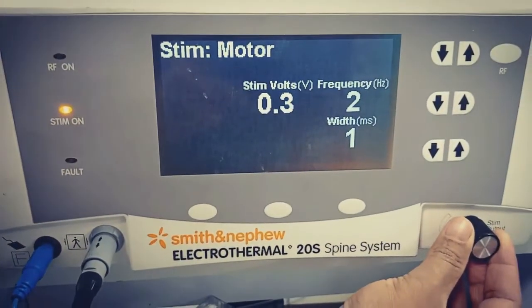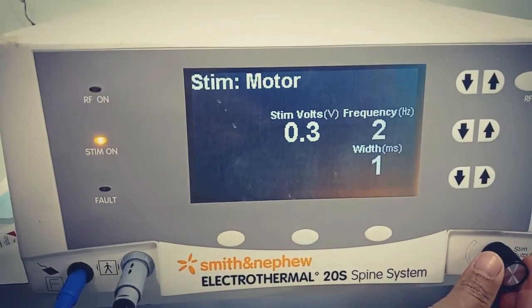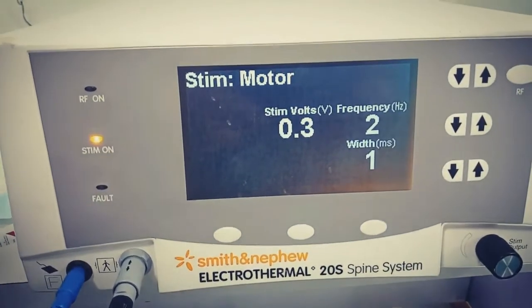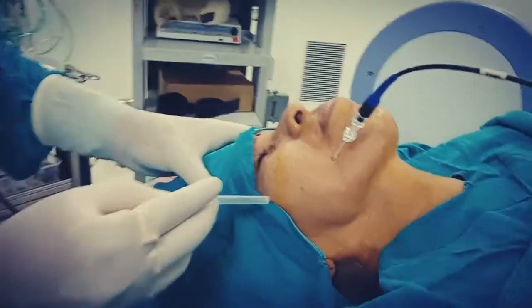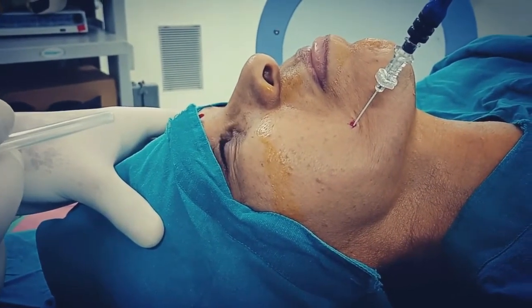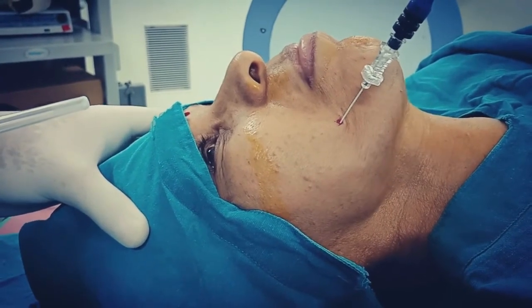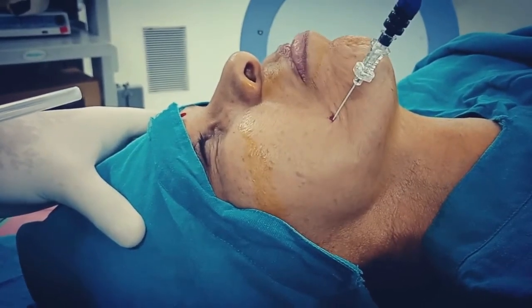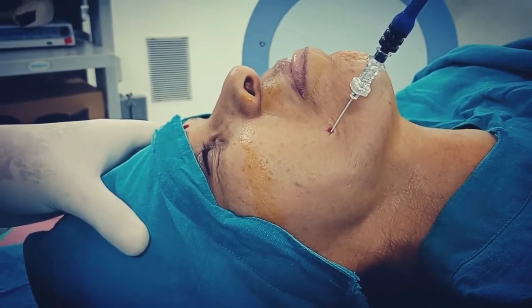Let's go for motor stimulation. At 0.3 mA we can get a twitch. Increasing to 0.4 mA — okay, fine. Increasing further to 0.5 mA — okay, fine.